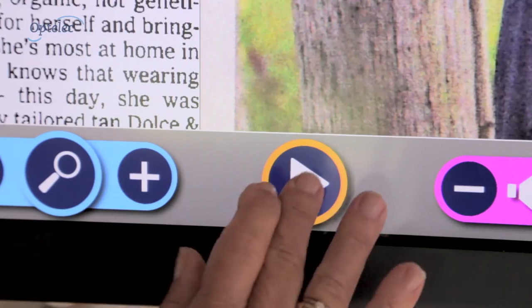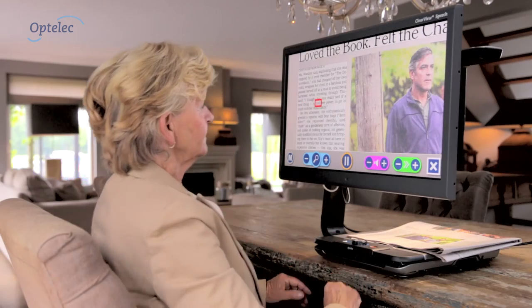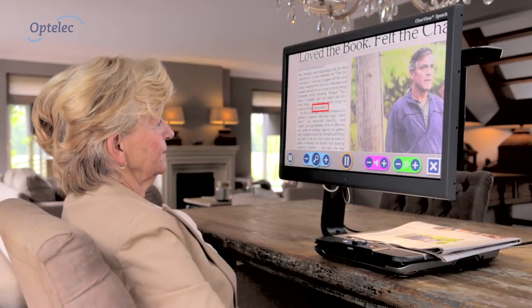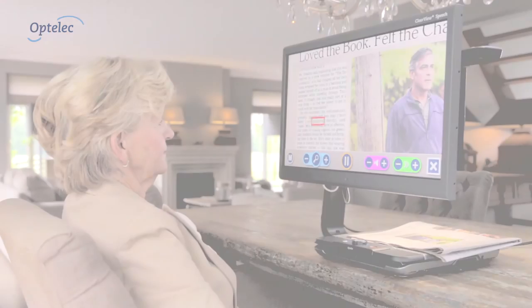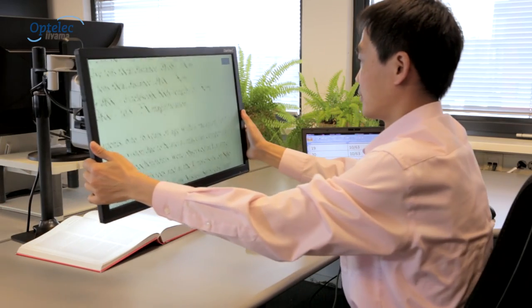Or use the speech module, which allows you to sit back and listen to text as it is read aloud. Choose the optional flex arm for a flexible workspace.